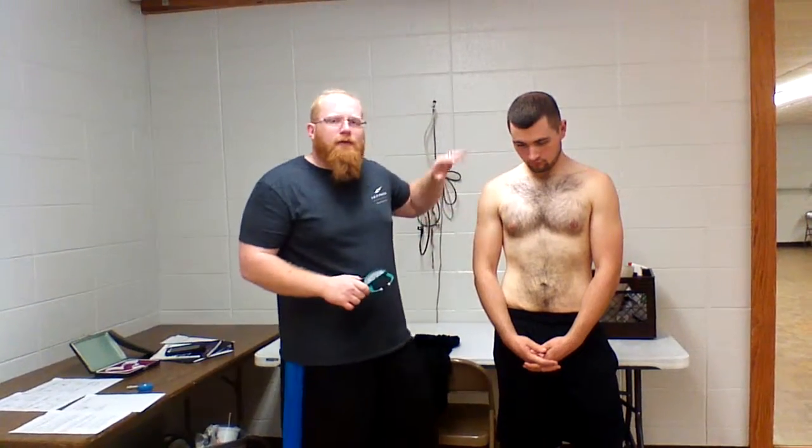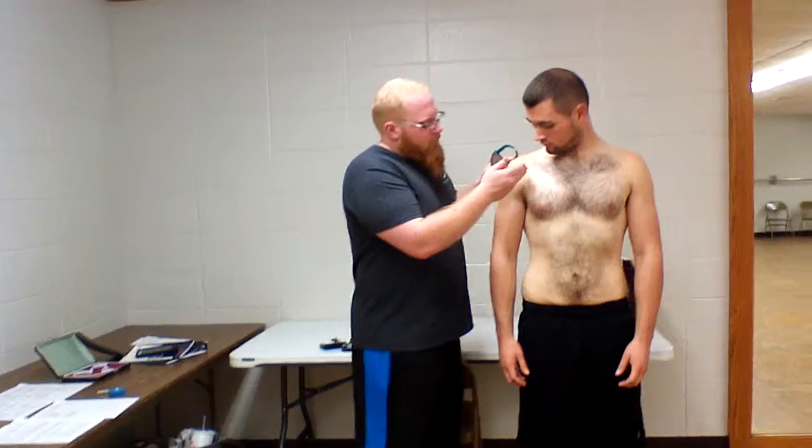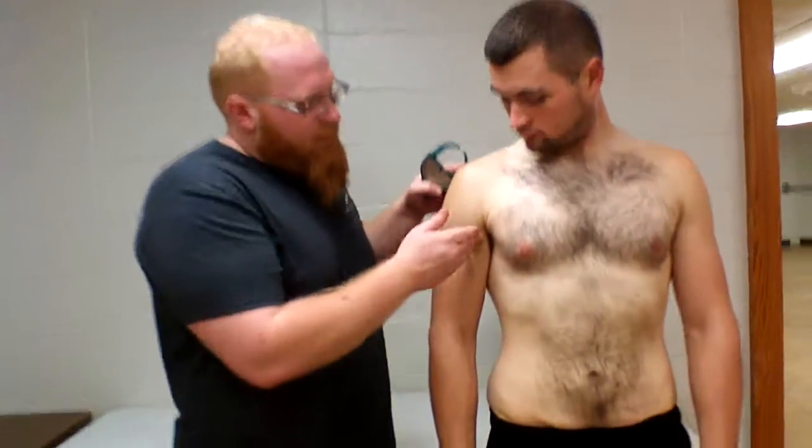So again, when you're doing these, you want to go through at least 2 times, just to make sure your readings are exactly the same and they're not different in any way. Earlier, when I was doing the chest, I didn't get a good reading, so we're going to redo that one. Again, it's just right between the crease and the nipple.